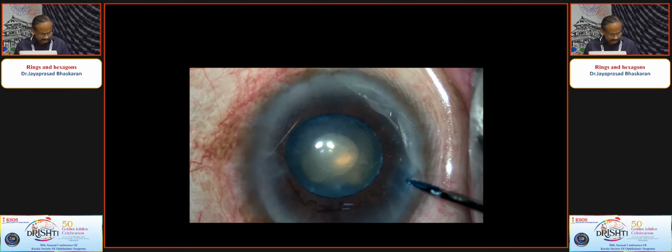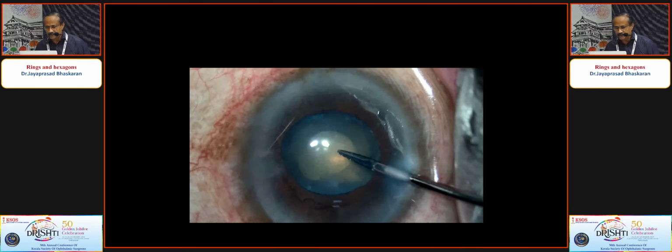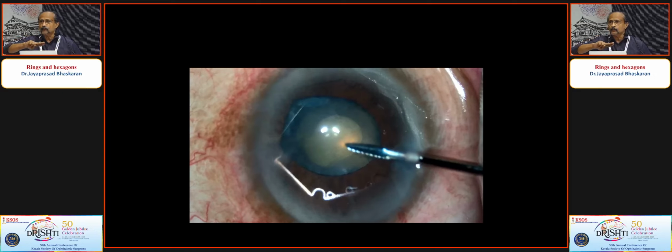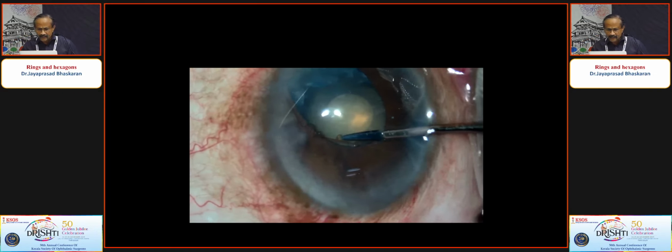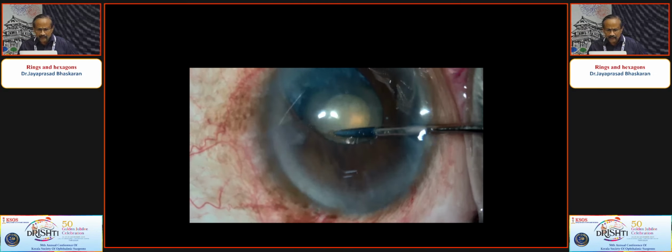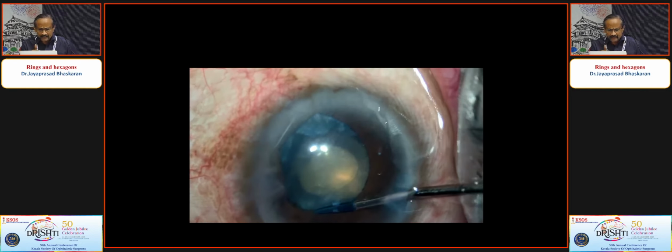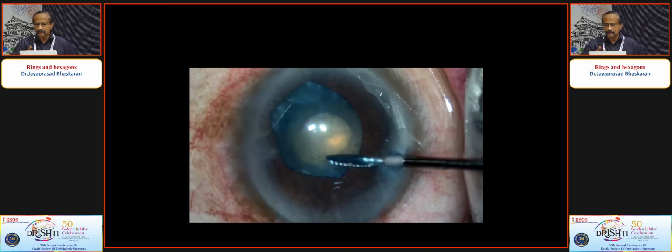Here I am using, finally yielding to that manufacturer constantly telling me to use these forceps, a 23 gauge forceps. It opens up and down and not laterally. So you can see that it opens like a crocodile's mouth actually. Catch, twist to one side, engage one end and then twist and get the other end in. See here, you catch, pull it to the center. So one edge is engaged, then you turn and put the other end.